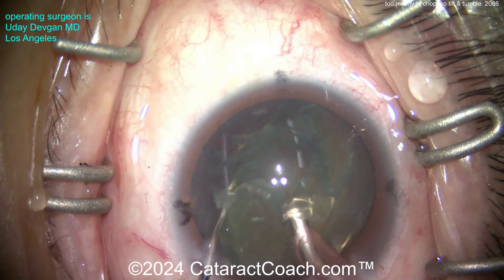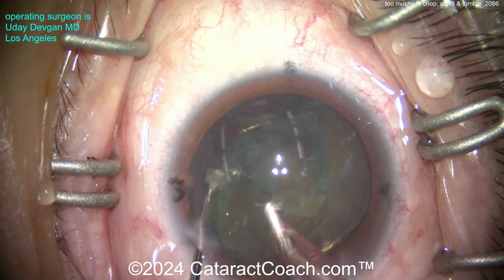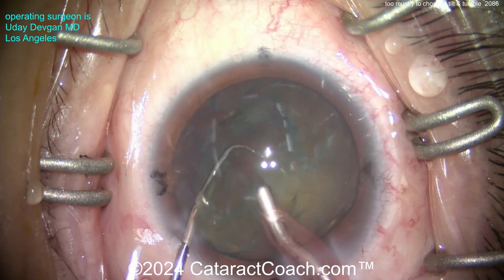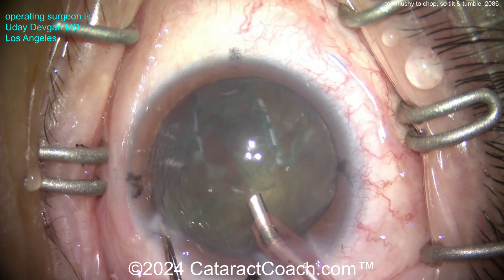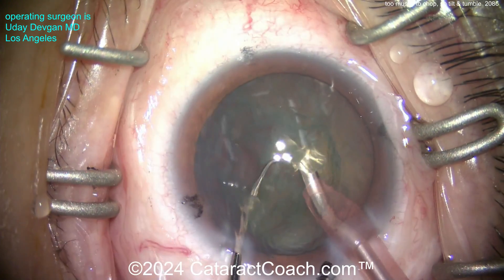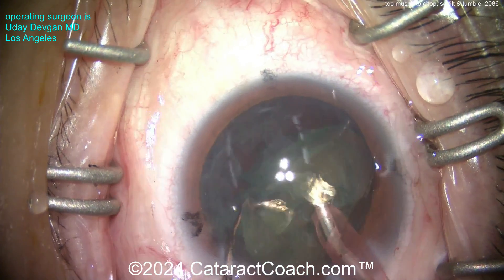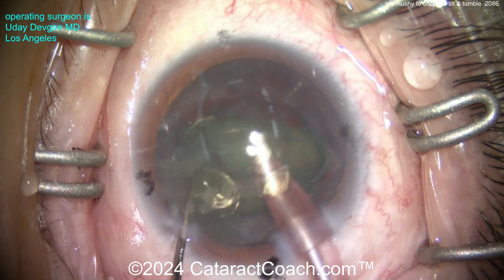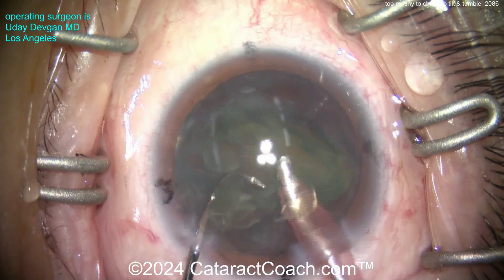Alright, probe back in the eye. Here's the chopper. Notice how we're just using the chopper to help tilt the nucleus more, to bring the nucleus closer to the phaco tip and away from the bag - not using the chopper to chop per se, but rather to manipulate the lens pieces. And there we go, getting them towards the tip.